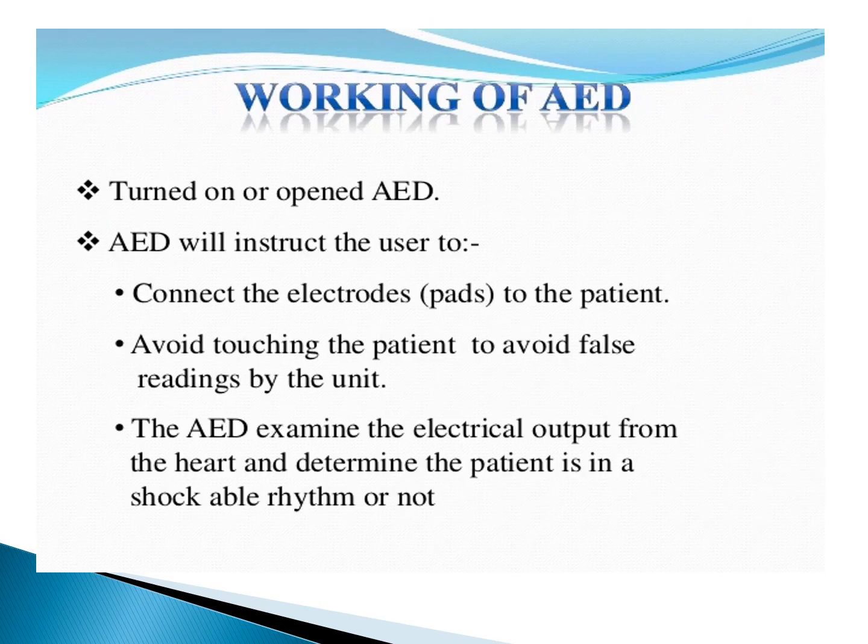Working of an automatic external defibrillator: we turn on or open the AED, and it gives the instructions. First it says to connect the electrodes to the patient and avoid touching the patient to avoid a false reading. The AED examines the electrical output from the heart and determines whether the patient is in a shockable rhythm or not.